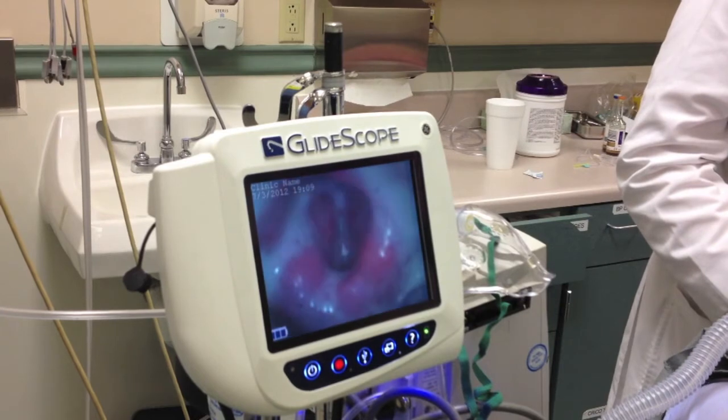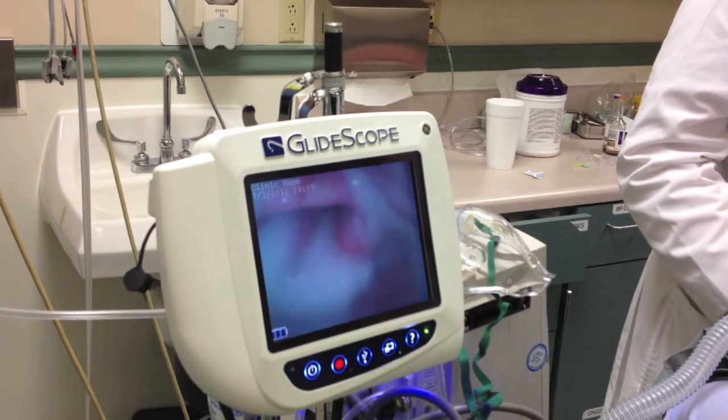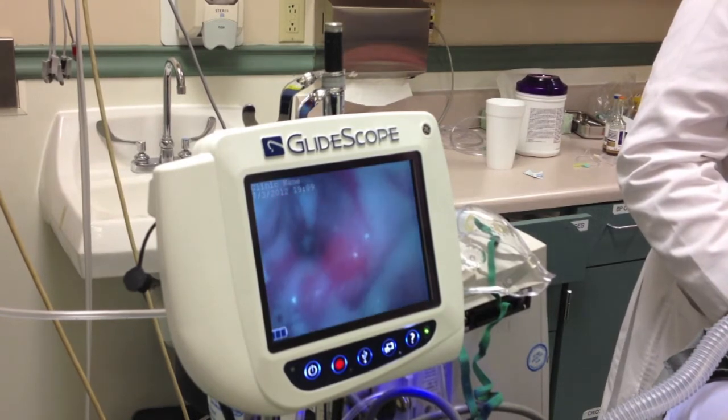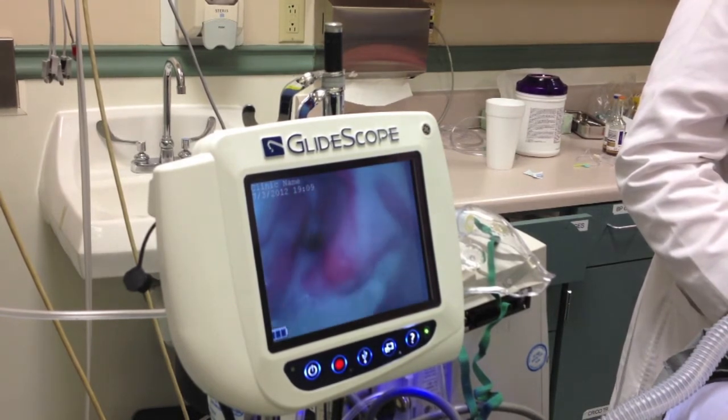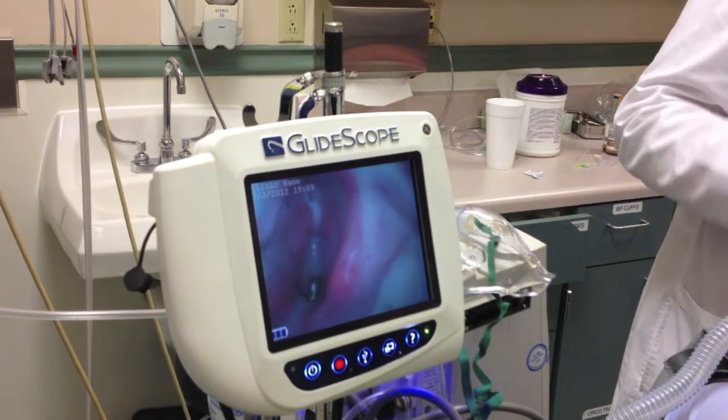You can see the airway starting to come into view right in the middle of the screen — that's the patient's airway right there. The epiglottis is coming into view on the top of the screen, and right in the middle area, those are the vocal cords. You can see them as the patient breathes in and out.